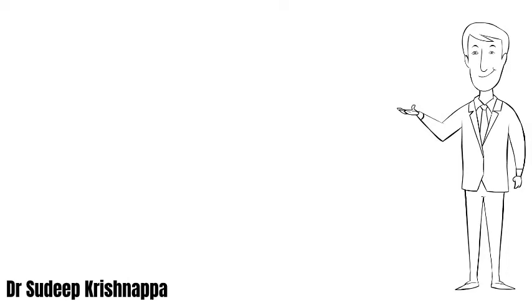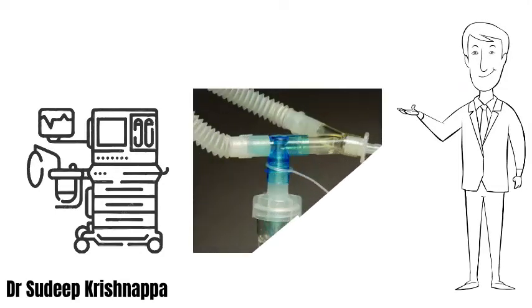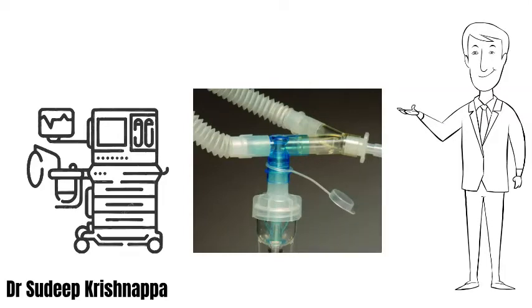The next problem you're likely to see, especially if you're nebulizing patients under anesthesia on an anesthesia machine or on a ventilator in ICU, is that the moment you start using these nebulizers, you would notice that the expiratory tidal volumes go all over the place. The ventilator would start alarming. The reason is the extra volume being added from the flow used to drive the nebulizer, as well as the extra volume added due to the entrainment of additional air, which adds on to the exhaled tidal volume, setting off the alarms.